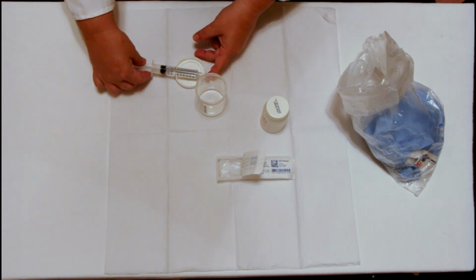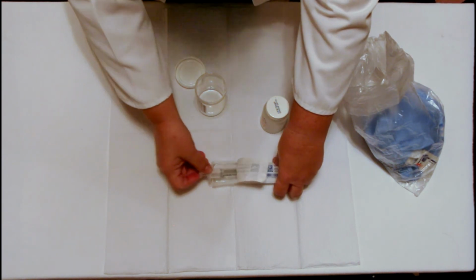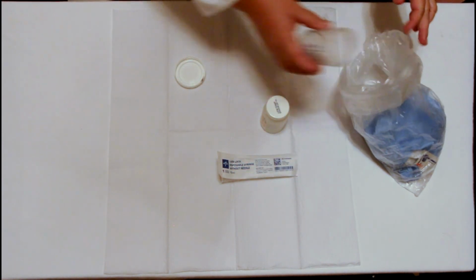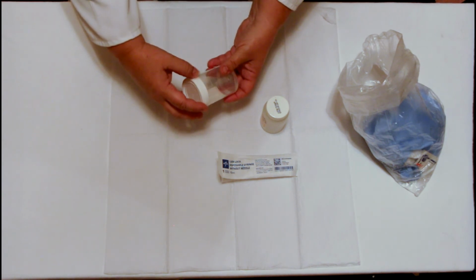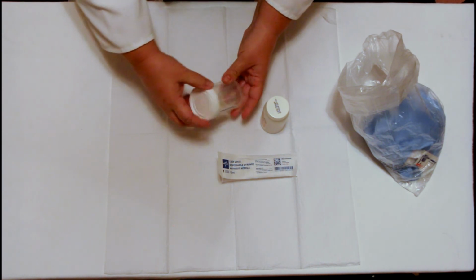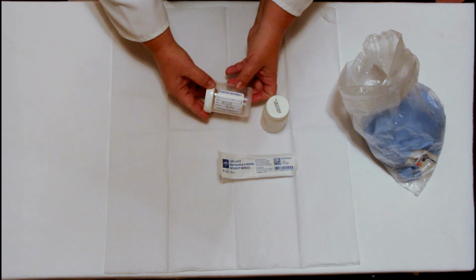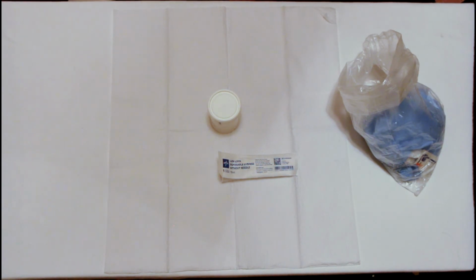Rest the syringe on the lid. Once you have completed your treatment, dispose of the solution and replace the cap. Place the syringe in a clean baggie or original packaging for safekeeping until the next treatment. The cup and syringe should also be dated and are good for 7 days as well.